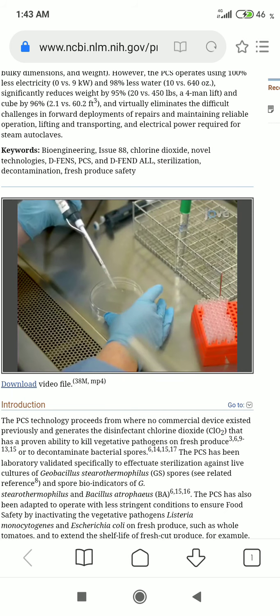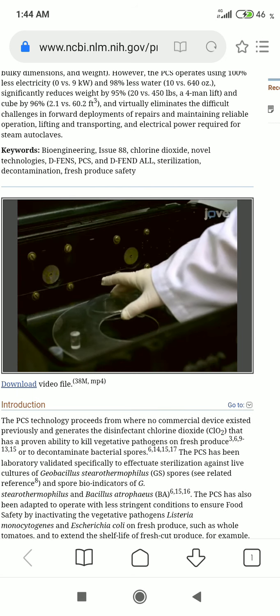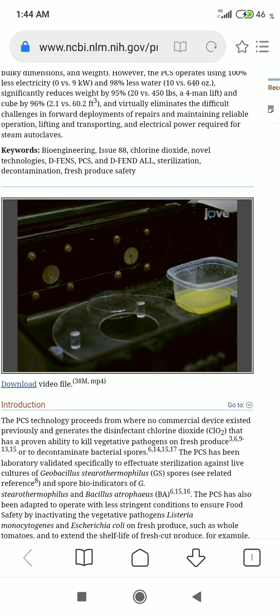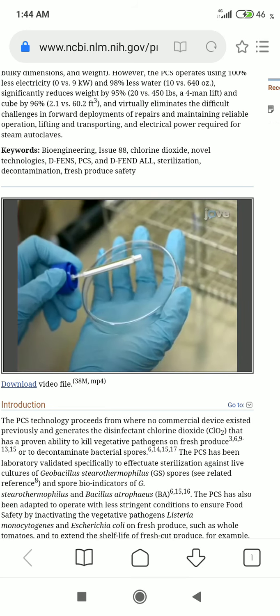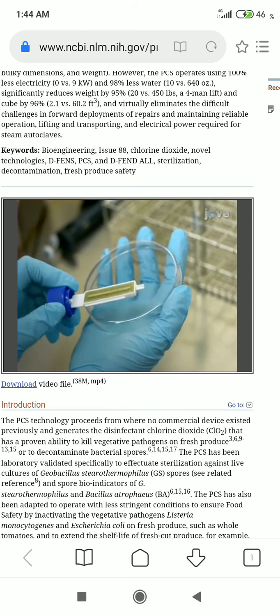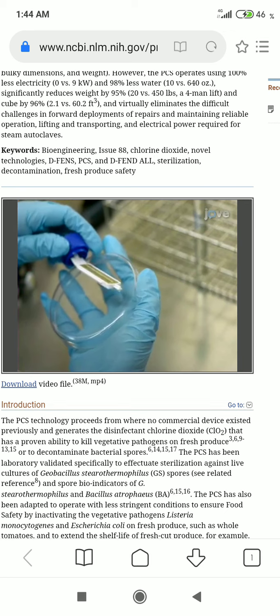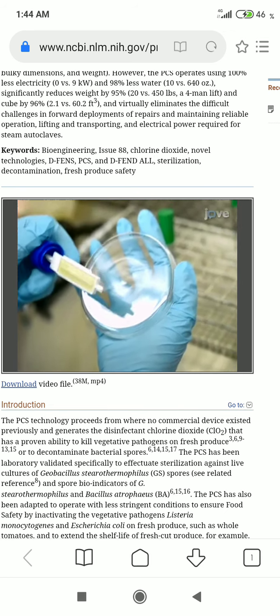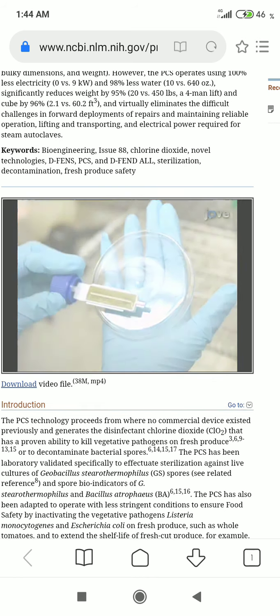For hard, non-porous surface sterilization, inoculate glass or metal surfaces with aqueous suspensions of B. stearothermophilus spores and air dry. Then, place the inoculated hard surfaces inside the PCS and expose to a sterilization cycle. Use commercially available high-check swab tests to recover spores from the surface. Obtaining no growth on the high-check swabs confirms sterility of the treated surfaces.